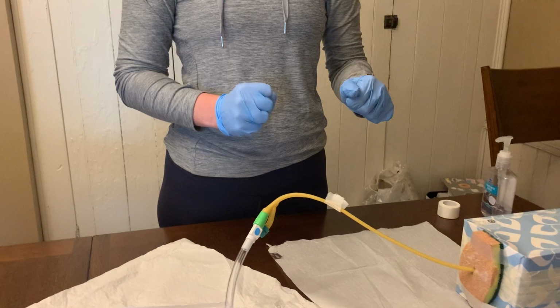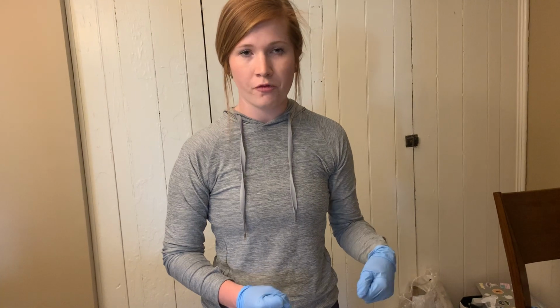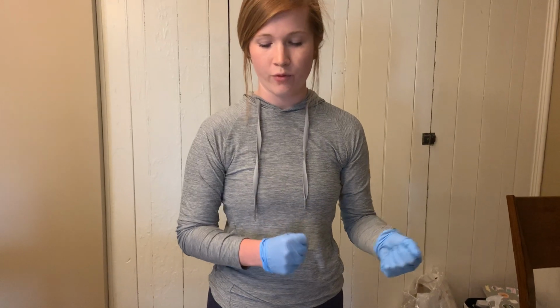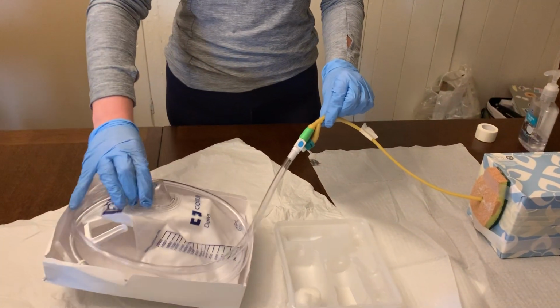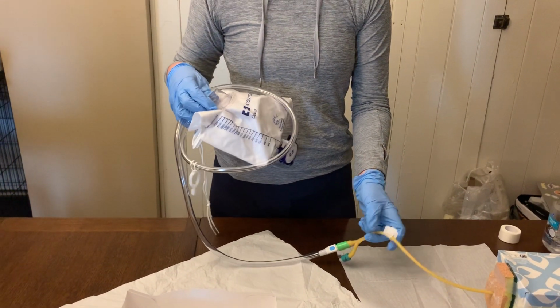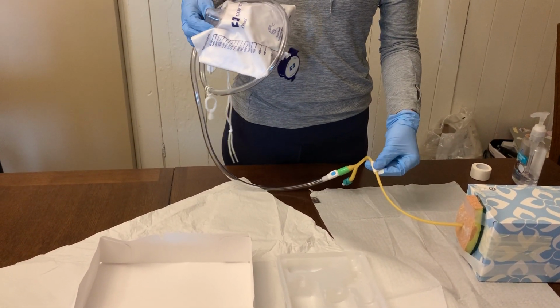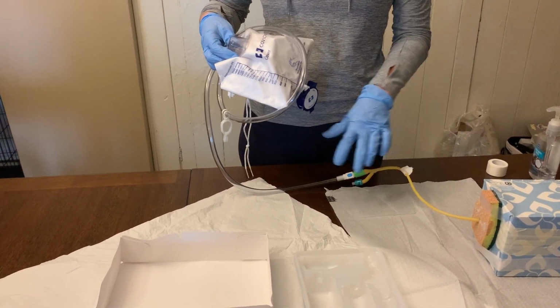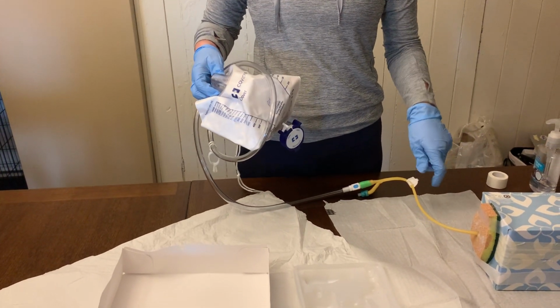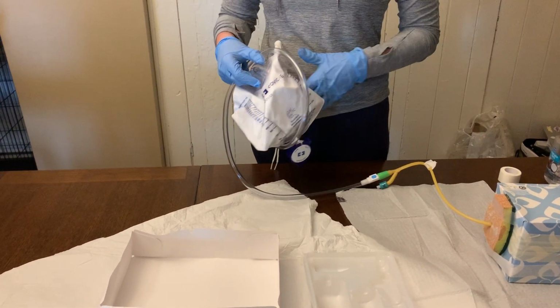If the patient said that it was uncomfortable or they were experiencing any discomfort, I could then withdraw the fluid, advance the catheter a little bit further, and then try to re-inflate that for them. I would, at this point, take my tubing and attach it with some tape, this leftover tape here. I have this here to signify that I would tape this to my patient's thigh. For a female, it would be taped to their inner thigh with just a little bit of slack. Since I don't have a non-movable part, I'm not going to be taping it, but I do have tape here, and that's kind of just to signify that I would do that.